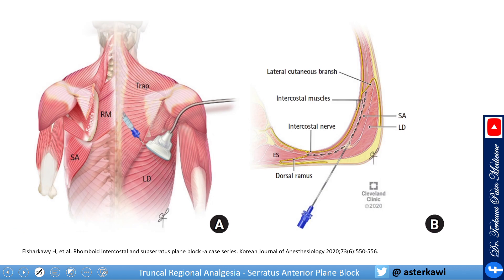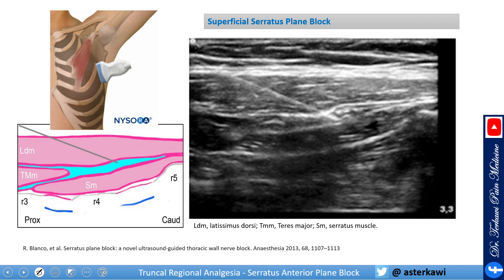Here are practical ultrasound images. You can place the probe in this region and see how the latissimus dorsi overlaps the serratus anterior — that is your target zone. For the superficial serratus block, you can identify the latissimus dorsi above and the serratus anterior muscle below. When you inject in the plane between them, that is the superficial plane block.